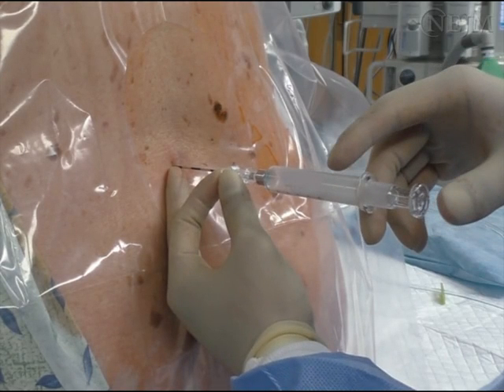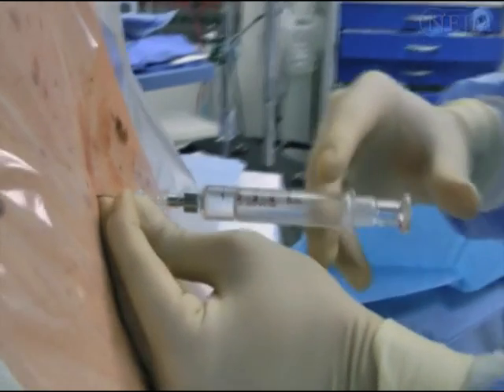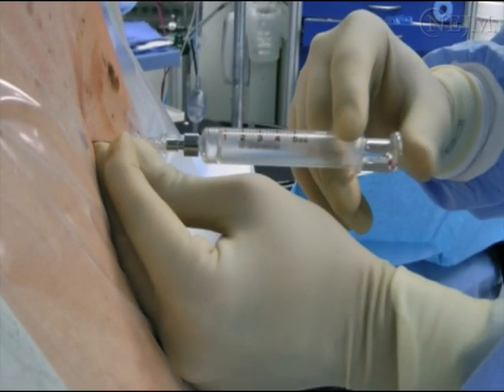Make sure to keep the epidural needle stable with the other hand. You will know you have entered the epidural space when there is loss of resistance, as indicated by a smooth collapse of the plunger into the syringe. Once you feel this loss of resistance, the epidural catheter can be placed.